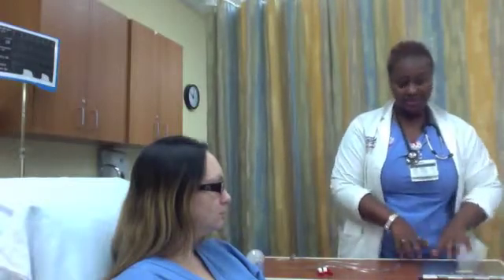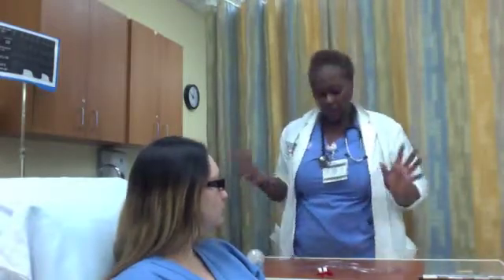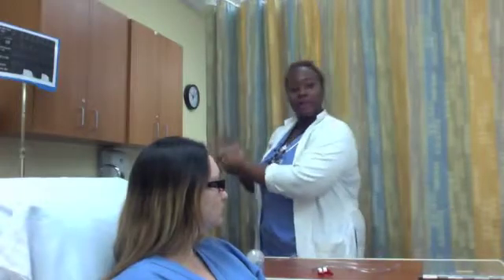Now we're going to go ahead and start the therapy. The first thing I'm going to do is assess and verify my physician's order. Then I'm going to wash my hands for about 15 seconds and don my appropriate PPE. I'm going to make sure that my patient sits up and I'm going to take my patient's breath sounds and vital signs, indicating that this patient actually needs this therapy.